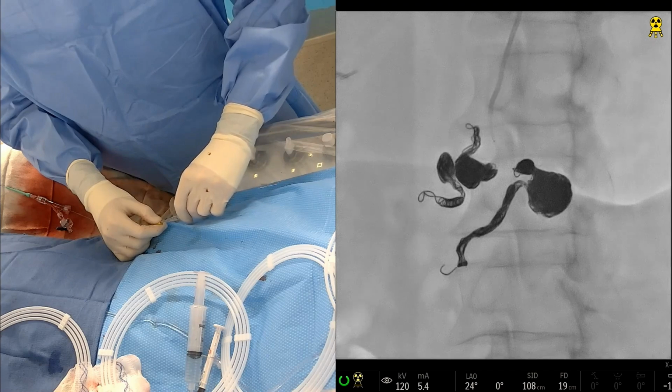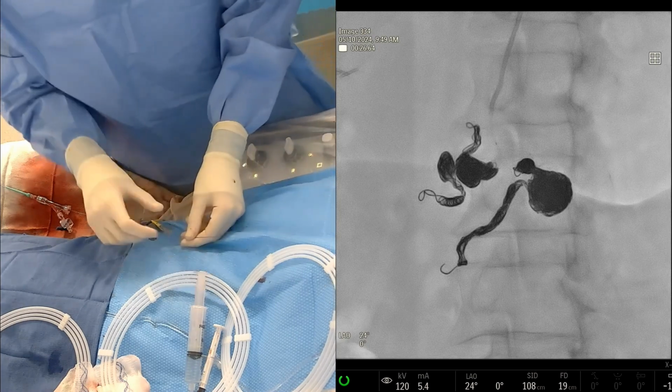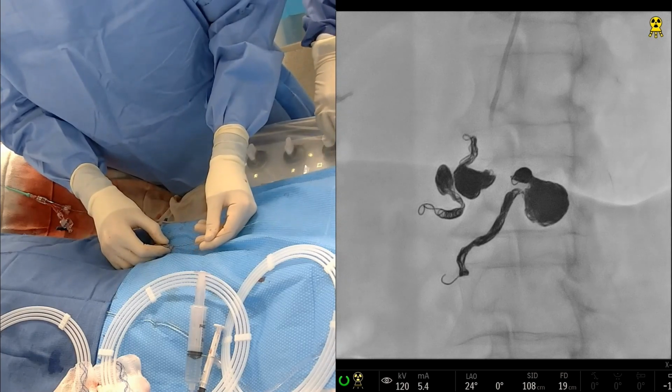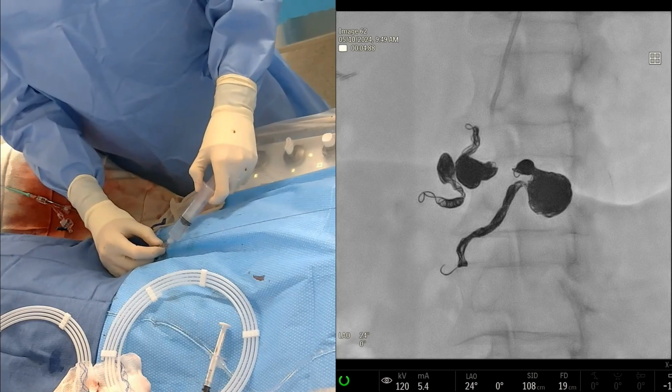There's always, it's almost like more. You sound like one of my reps now. You can do one more, right? I would do one more, Gary. I agree, one more coil. Okay, and then I think we're done. All right, could we have one more 415? Pretty done. It looks amazing.